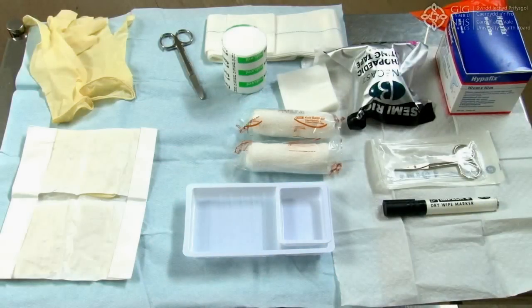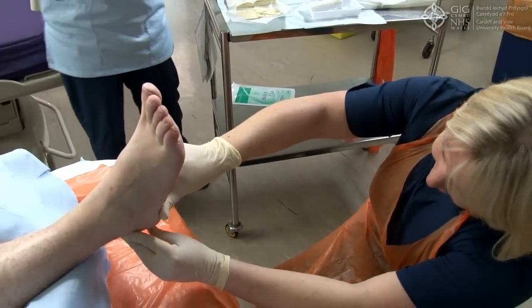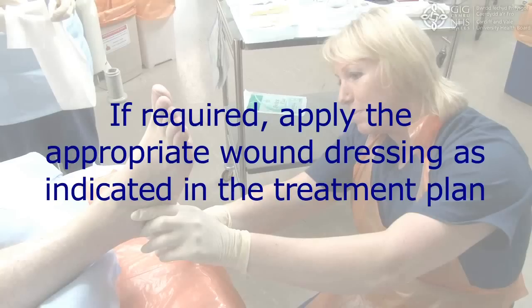Preparation is the key. Make sure everything you need is to hand before you start. Inspect the foot and particularly the heel to identify the area which requires pressure relief. If required, apply appropriate wound dressing as indicated in the treatment plan.